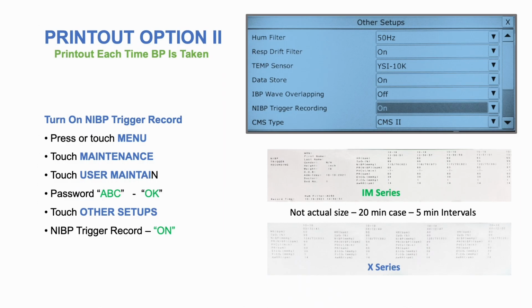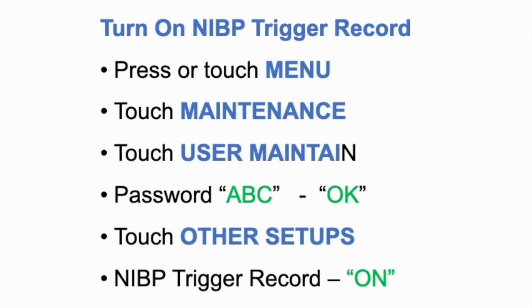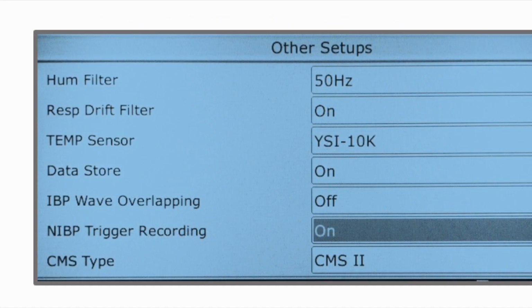Option 2, print out each time a blood pressure is taken. By default, Trigger Record is set to off. In order to print each time a blood pressure is taken, NIBP Trigger Record needs to be turned on. Press or touch Menu, touch Maintenance, touch User Maintain, Password ABC, touch OK. Touch Other Setups. Set NIBP Trigger Record to On if you choose to print each time a blood pressure is taken. Otherwise, leave this set to off.